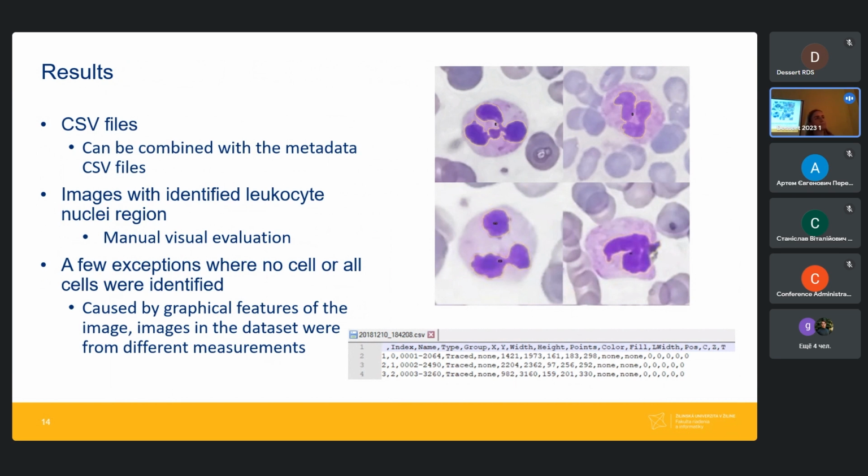This solution is creating new data sets, because from experts we need few markers in places, and this solution makes it on all data sets. It produces a new data set of the blood cells with labels, in a JSON or CSV file, which can be used in further studies in this form.